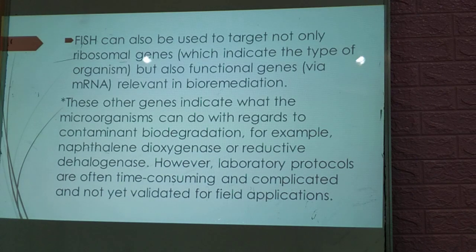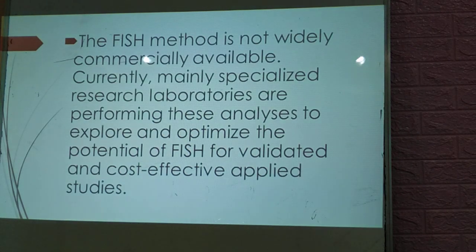But again, this is mostly in microorganisms, but when it comes to tumor markers, they are already established. The FISH method is not widely used commercially, or it is not widely commercially available. Currently, many specialized research laboratories are performing this analysis to explore and optimize the potential of FISH for validated and cost-effective studies. But always remember, its main difference is that we are examining the presence of that fluorescein labeled probe inside your cell while it is still inside the cell.